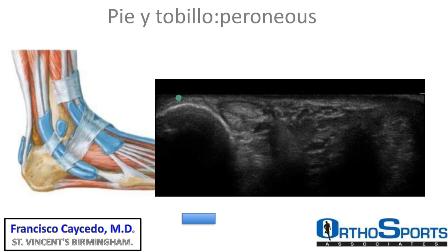It's very, very important that you first become familiar with the studies, and also with the normal anatomy of every patient, and then you start with the contralateral extremity, and then you correlate with the symptoms and the signs of the patient to really interpret the studies, and then it gives you a better diagnosis and future treatment. Normally, you can see some fluid, but if it's increased, there can be signs of tenosynovitis or ruptures.